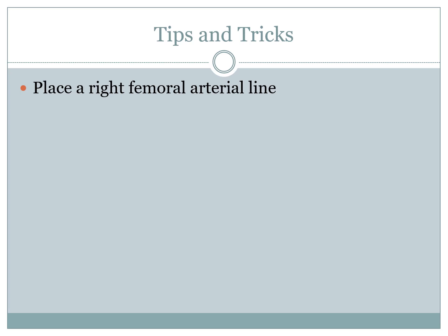So by placing a right femoral arterial line, number one, you have a very good access that you can give to your anesthetists to show a good arterial pressure tracing, but also if you run into troubles during your sternotomy, you can very quickly place a percutaneous arterial cannula in while you can recycle some blood through sucker bypass if necessary. You do have to cut down on that cannula at the end of the case to remove it, but it's a very nice safety net that does not take very much time out of your operation at all.